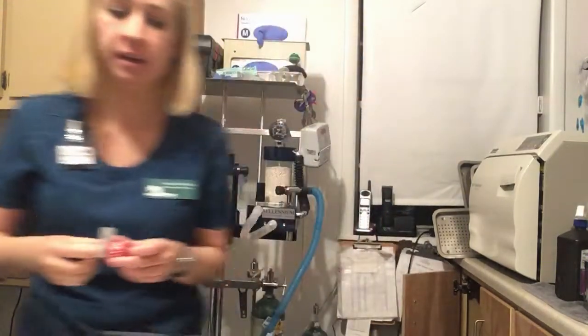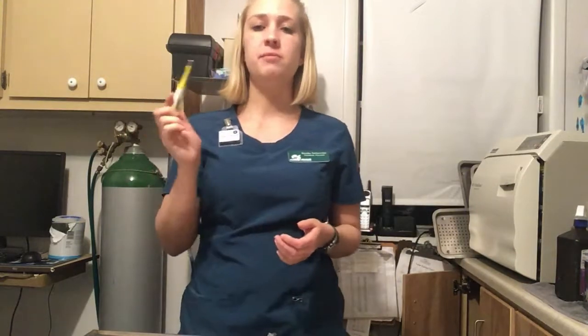There you go. Another important step in monitoring the patient under anesthesia: since the patient tends to get hypothermic while under anesthesia, you want to monitor their temperature and make sure they're not dipping too low. We use just a regular thermometer that is inserted into the rectum and is monitored every 15 to 30 minutes or so.